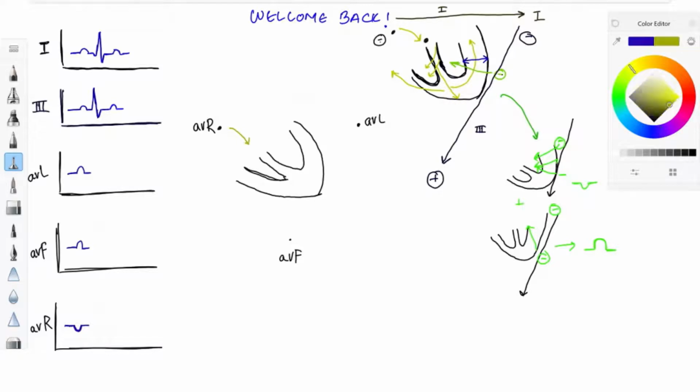So the next step is septal depolarization, which is left to right. Towards the apex. And it just shows how the current is simultaneously being recorded in all the leads, going away from one lead, going towards the other lead, and that basically is the basis of how the ECG current is recorded on the paper, whether it's positive deflection or negative deflection.